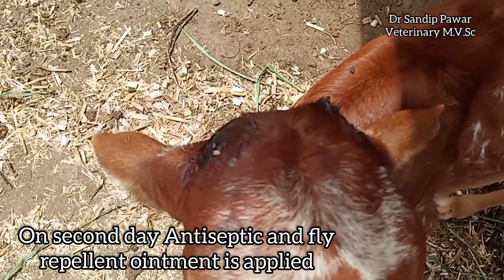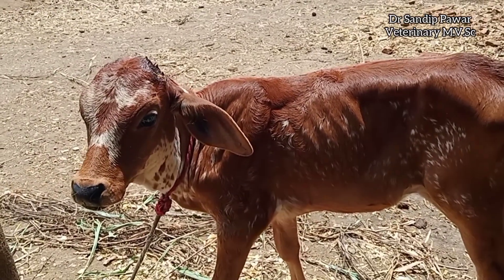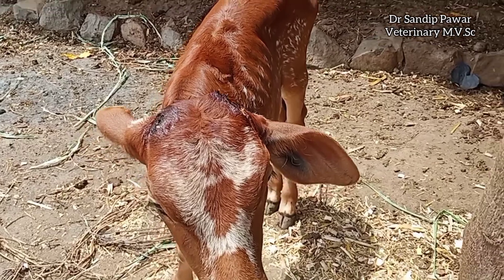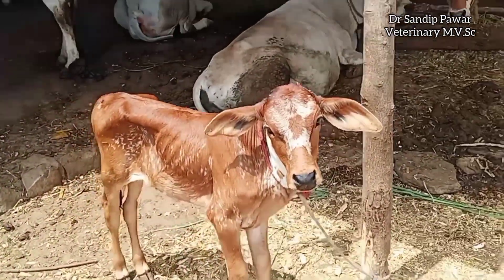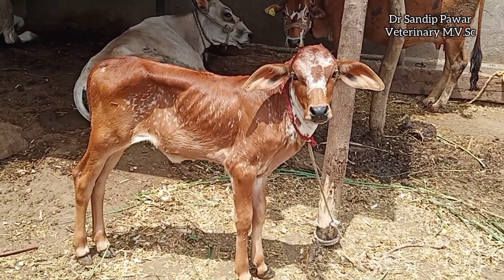Advantages of this hot iron disbudding are that it is a bloodless procedure and it can be used in calves up to 4 months of age. Once the disbudding procedure is complete, the calf should be given non-steroidal anti-inflammatory injections for the next 2-3 days.